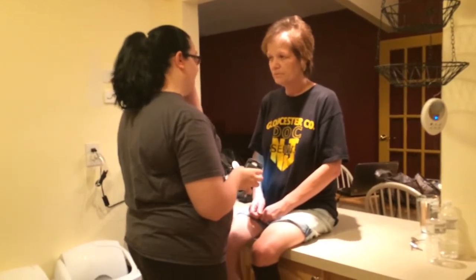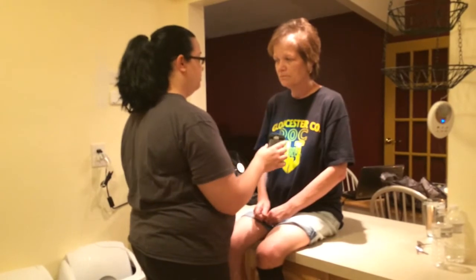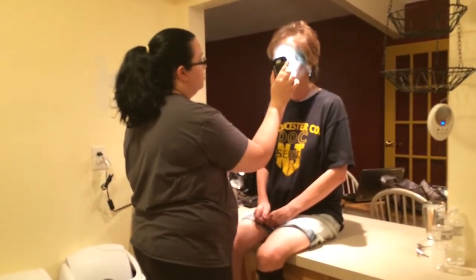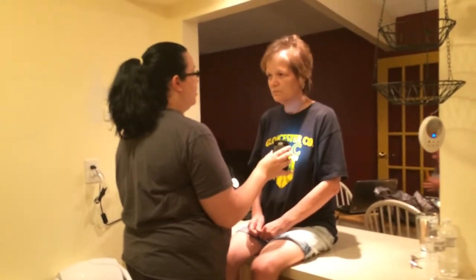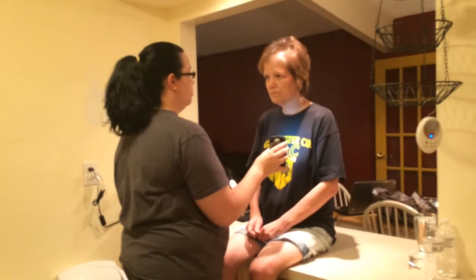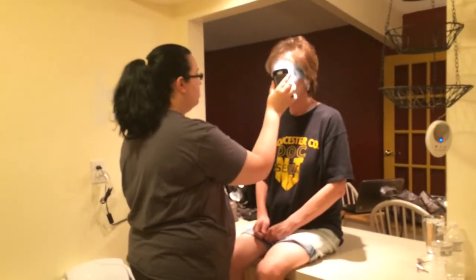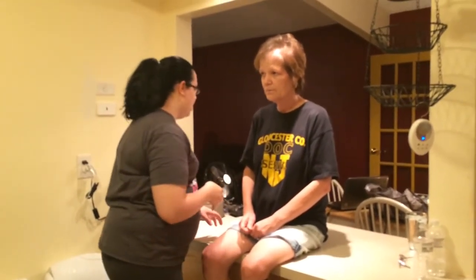Now I'm going to check for direct and consensual pupillary reaction. Direct would be when I shine the light directly into the pupil, that pupil should constrict, which it does. Consensual would be when I shine the light into that same pupil, the opposite pupil should also constrict, which it does. Okay. Also, when I was checking for foreign bodies and any abnormal coloring, there was none.